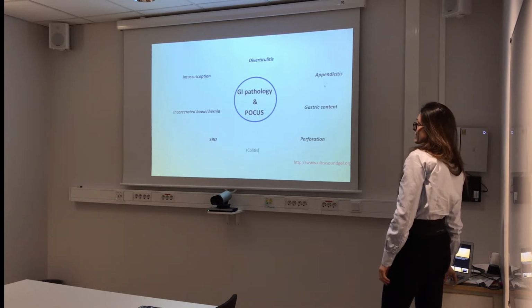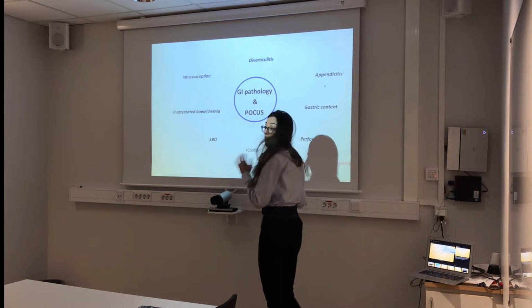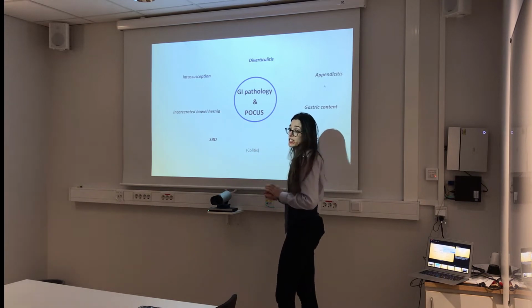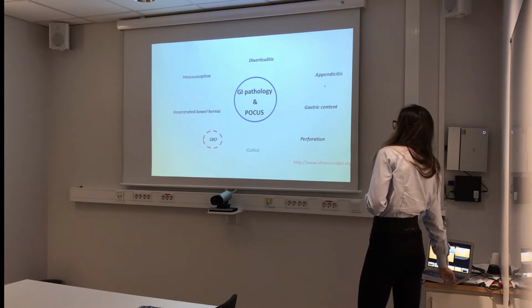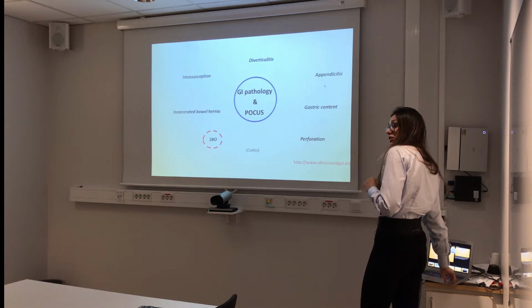Okay, and colitis. This is more specific for the sonographer than for point of care ultrasound, but there are some peculiar aspects of the abdomen that you should know regarding colitis, which is something that you can see with the ultrasound very well, especially in Crohn's disease and in ulcerative colitis.